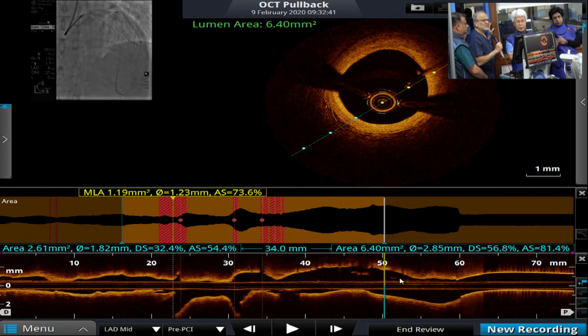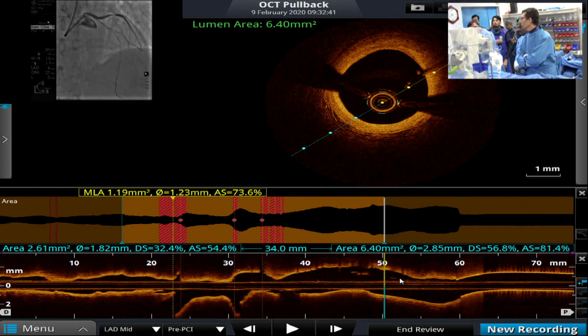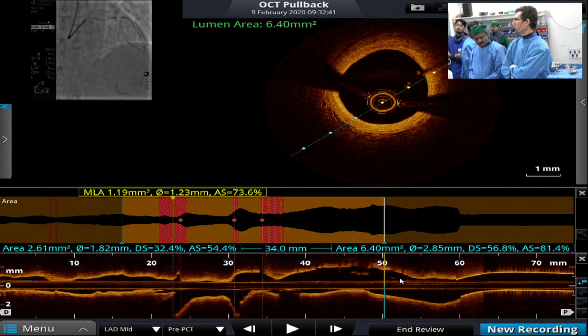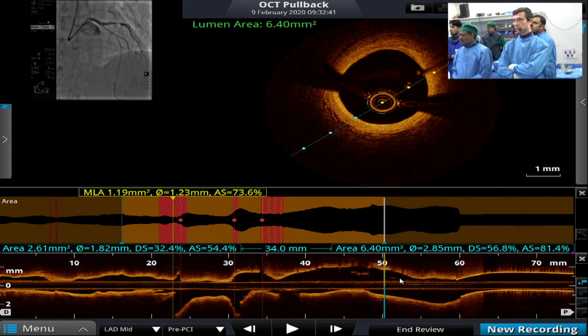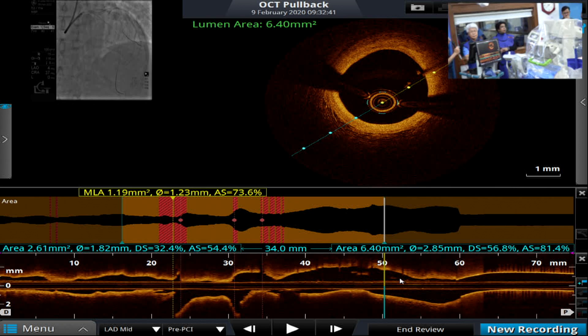And then the proximal diameter of the vessel, proximal to the diagonal, what's the reference there? It is 2.85. Okay, 2.8. So we can crank up a balloon there, and I think it will look beautiful, with preservation of the two branches. What length? 2 by longest, please.